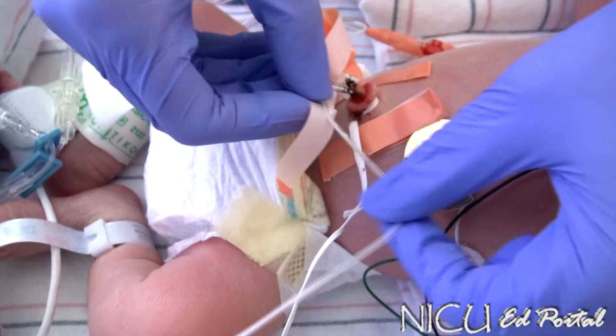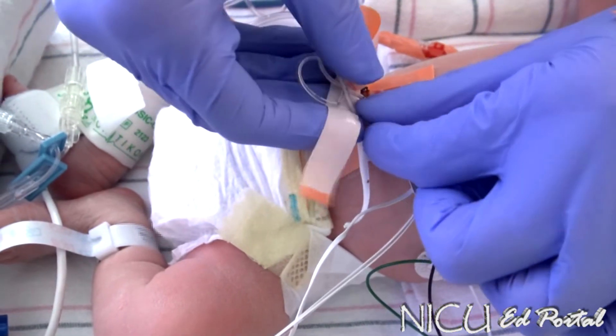I usually have one coming up and one going down because it just makes it easy to distinguish which is which.